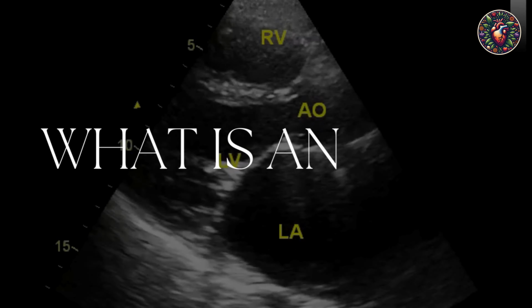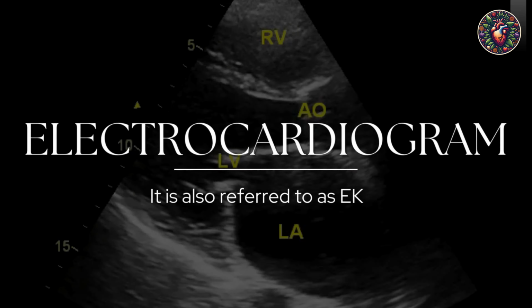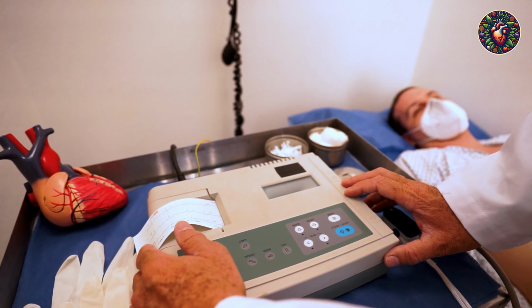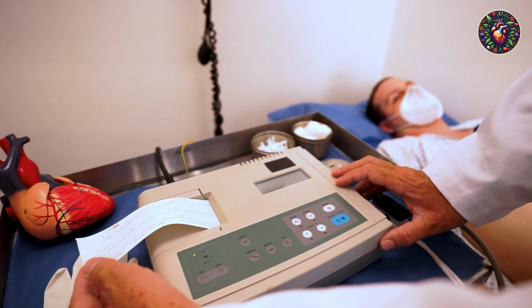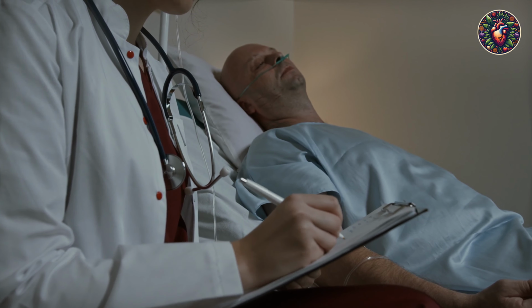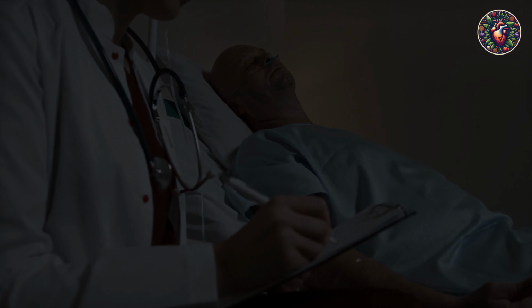What is an ECG? ECG stands for electrocardiogram, and it's sometimes referred to as EKG. It's a graphical representation of the electrical activity of the heart. The electrical impulses or waves that trigger the heartbeat are recorded by an instrument called an electrocardiograph. The ECG allows doctors to examine how well the heart is functioning, whether it's beating normally, and if there are any abnormalities in the heart's rhythm or electrical activity.